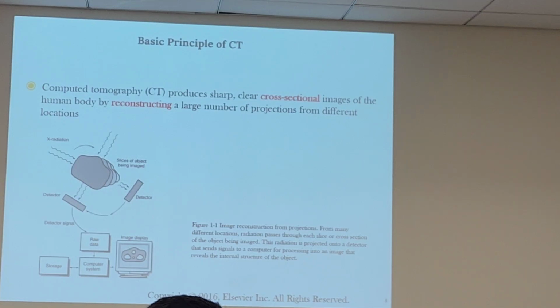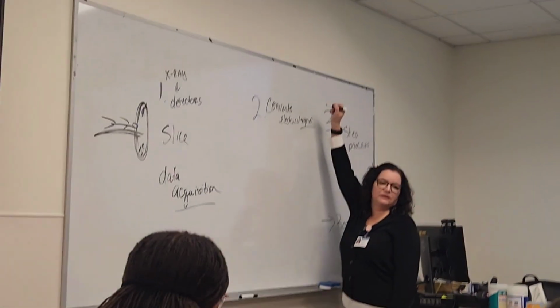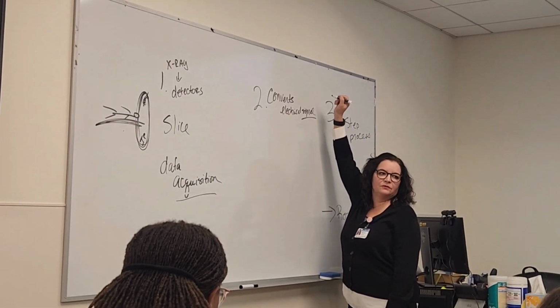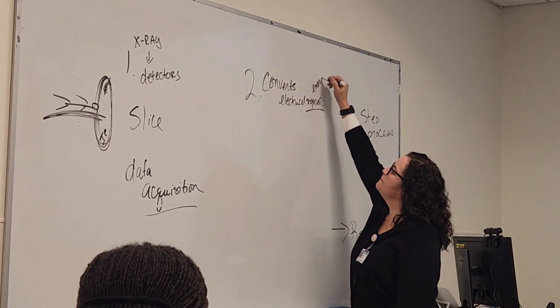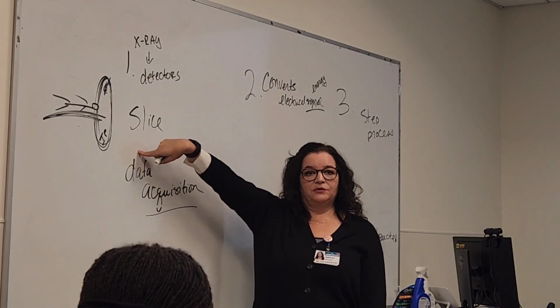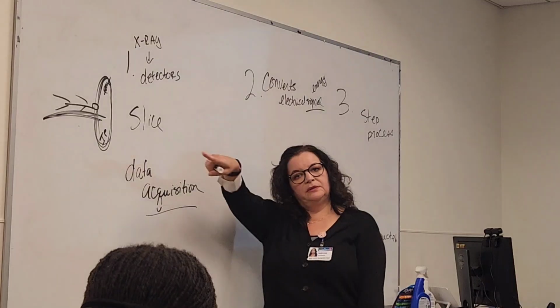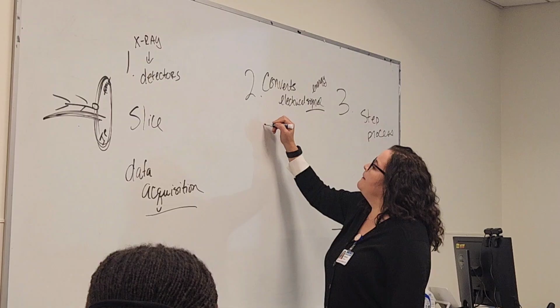To convert it. I like conversions. And so what converts an electrical signal? Signal is basically what? What is the signal also associated with? When we think about noise to signal ratio, signal to noise ratio, we think about energy. Did we just capture energy over here? Yep, we captured it, right? X-ray energy is converted into an electrical signal, and then we're now going to convert that into a what? Digital.